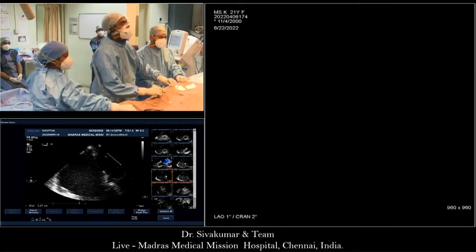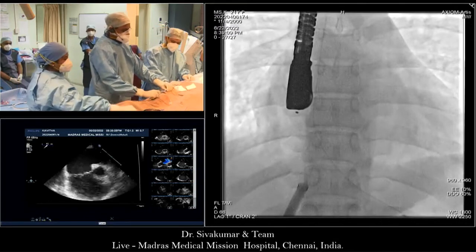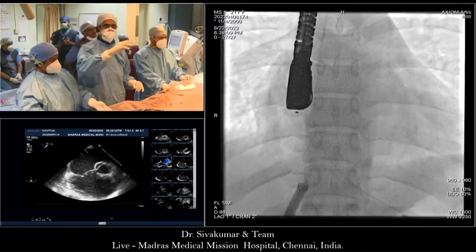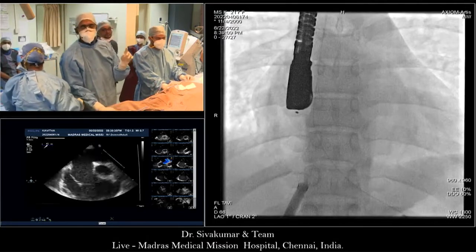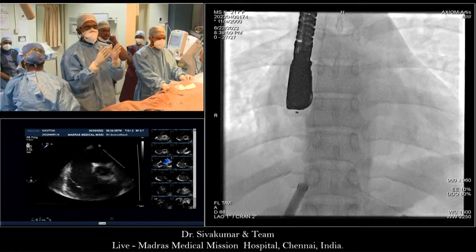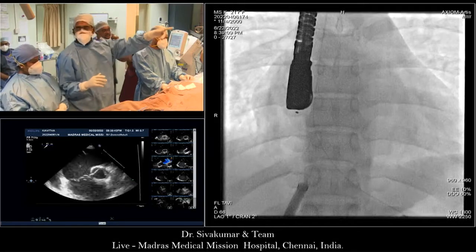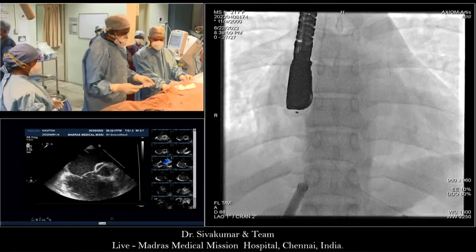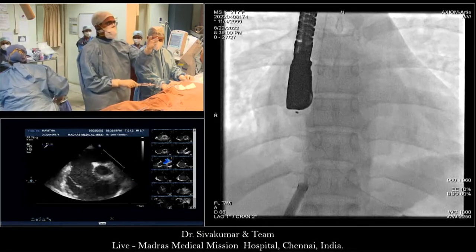You've made him change his mind now. Bharat, what were you going to say? My only thing was, before retrieving the device, if you could have just measured the waist of the device. Put it back in, Shiva. Bharat, I was precisely telling the same thing. Actually, the posterior, inferior margins of the device were all touching each other. Yeah, my only thing was, with that kind of touching of each other, what was the waist size? It would have been good to have some idea.